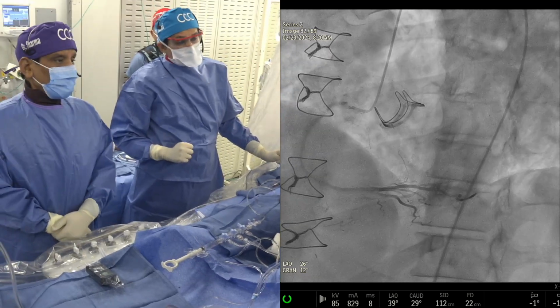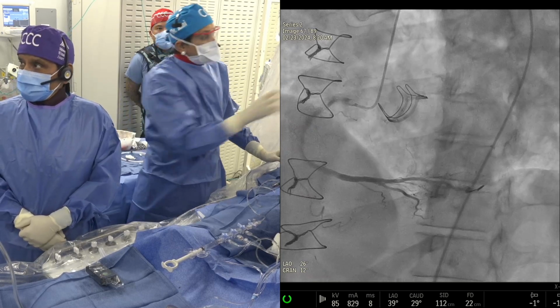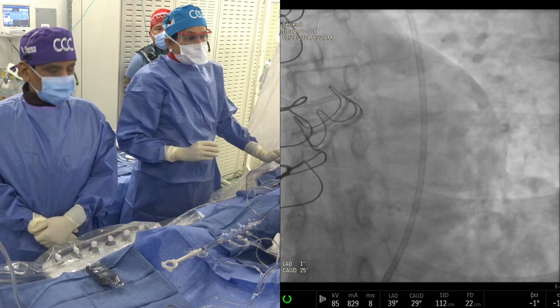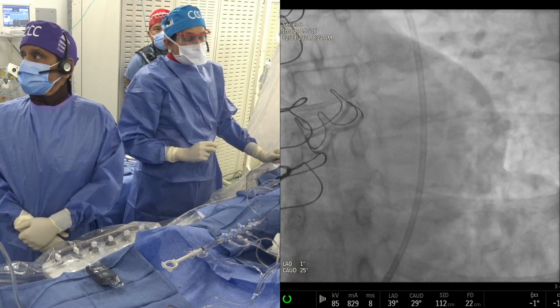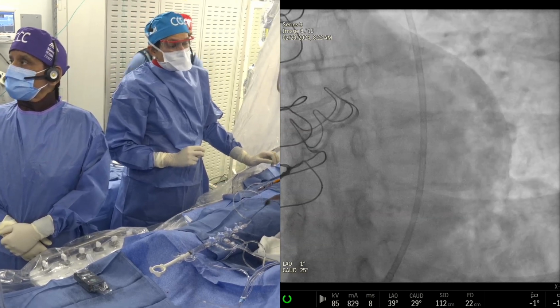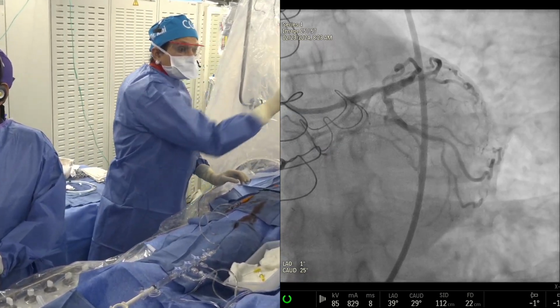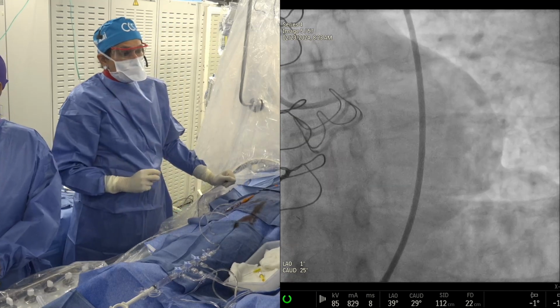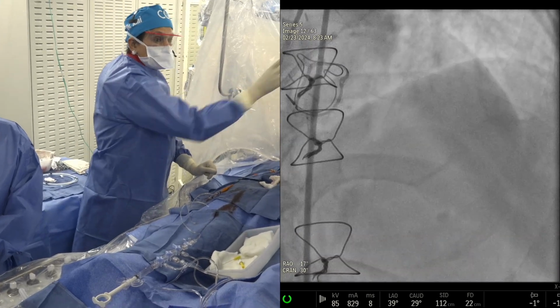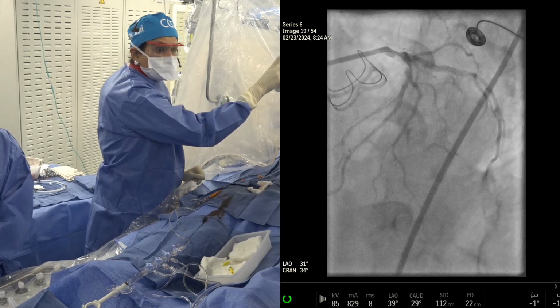Vanu, show it. So can we show the angiogram? Yeah, right coronary artery, which is normal. Yep. And then we are going to the left side. This is just a dry cine to understand the amount of calcium. If you see here, tram track calcium, distal left main, most of it in the LAD. Then you see it also in the circumflex. And this is how the angiogram looks. So eccentric lesion even on angiogram in the distal left main. Now the cranial view, we have done multiple views, does not look too bad.